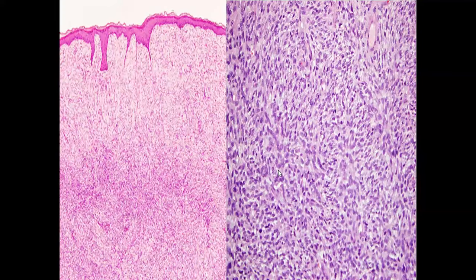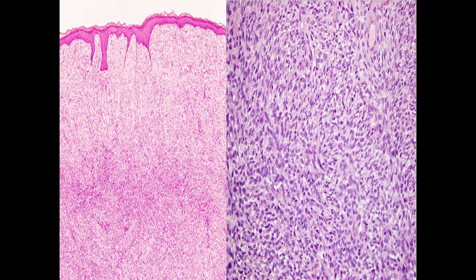Dermatofibrosarcoma protuberans (DFSP) contrasts with dermatofibroma: in DFSP the overlying epidermis is thinned out, the connective tissue tumor starts from the papillary dermis, involves the whole dermis, and even infiltrates into the subcutaneous fat. On higher magnification you can appreciate the storiform pattern — the distribution of fascicles of collagen running in different directions.